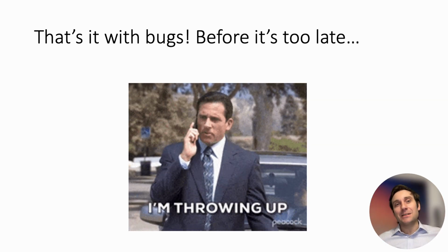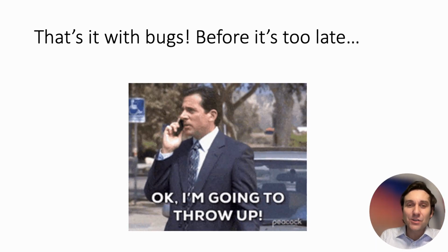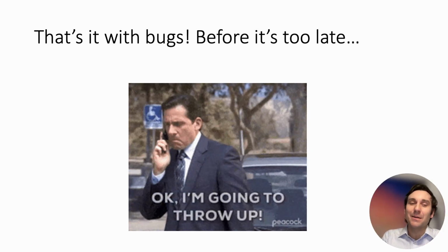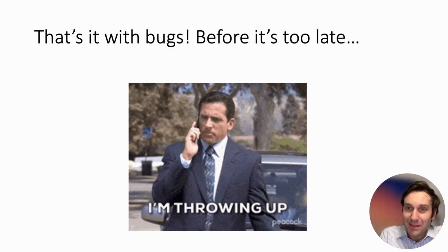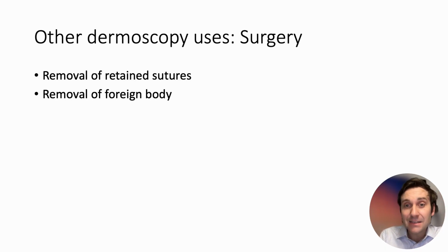And that's it with bugs. I mean, we're done here. But before I'm done, and sorry Natalia, if I'm a bit over my time. I don't know if it was 20 or 30 minutes. Sorry about this. I want to show you other uses of your dermoscope. And yes, I am a surgeon, right? I do most surgery, and I use my dermoscope for margin delineation, for pre-surgical evaluation, but also for removal of retained sutures, for removal of foreign bodies.